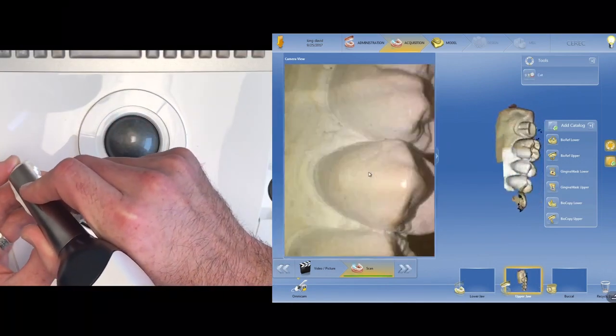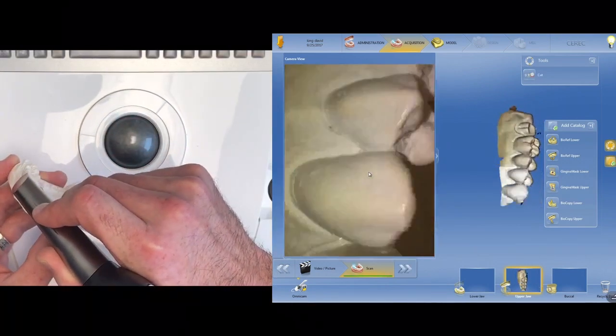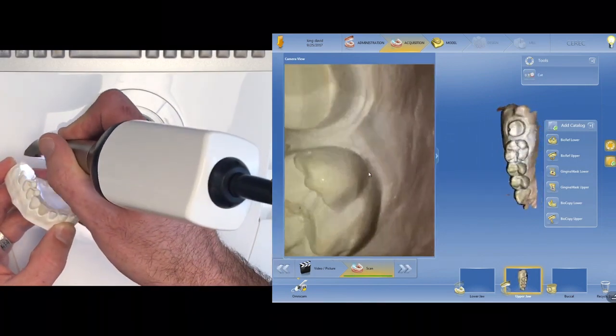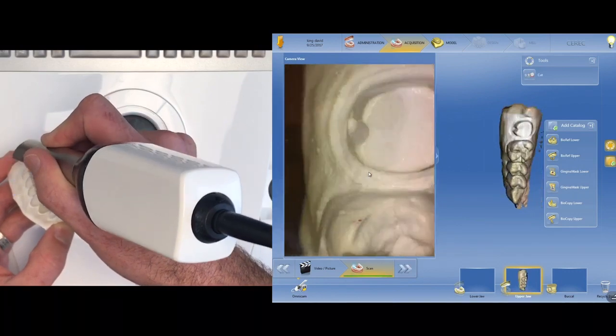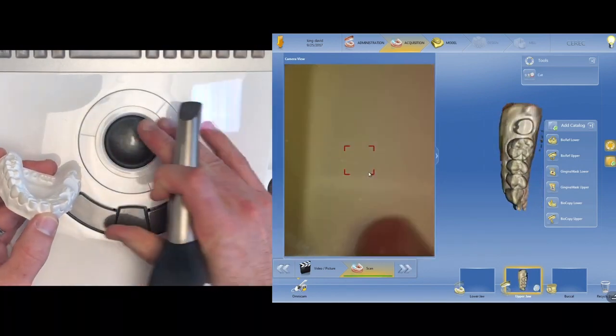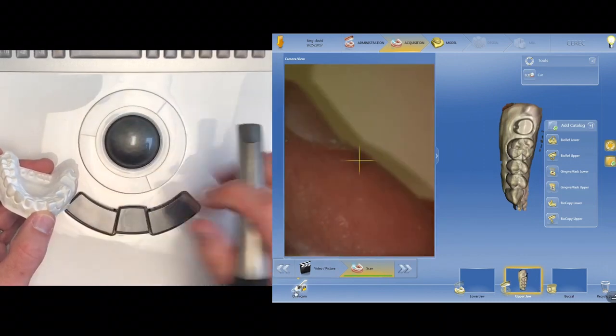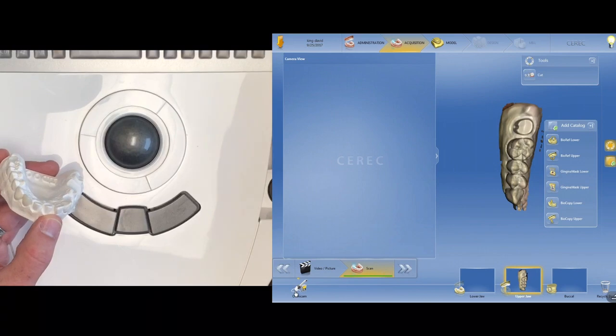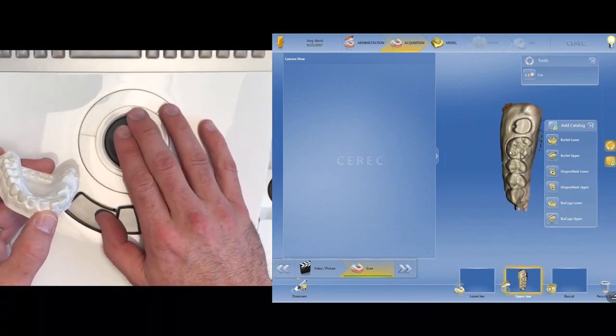And I found that the less you image, the faster the machine goes in processing the restoration, but it also sometimes will give you a less precise image if you don't get enough details. So spend enough time to get good images. So that's about all that I need there. I'm going to turn off the camera, put it back in its little holder, and latch it. Now let's take a look.